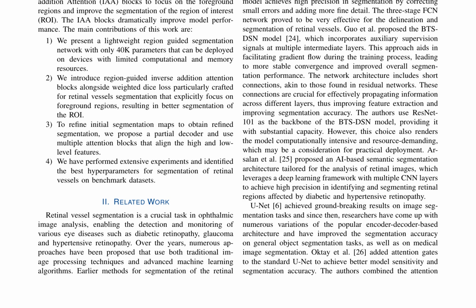region of interest (ROI). Key contributions include a lightweight region-guided segmentation network with only 40K parameters, suitable for deployment on devices with limited resources. Region-guided inverse addition attention blocks and weighted dice loss tailored for retinal vessel segmentation. Partial decoder and multiple attention blocks aligning high and low-level features. And extensive experiments to identify optimal hyperparameters for retinal vessel segmentation on benchmark datasets.